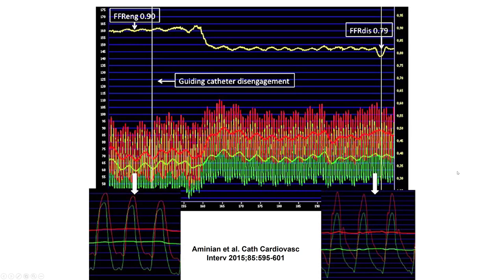It is also important to perform a pullback and check that there is no dampening of pressure from the guide catheter. This is an example of guide catheter dampening — we can identify it because the waveform in the guide is ventricularized. After the guide is disengaged, the ventricular waveform normalizes, and now we can see a significant FFR.